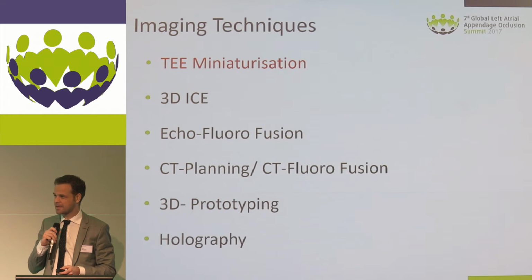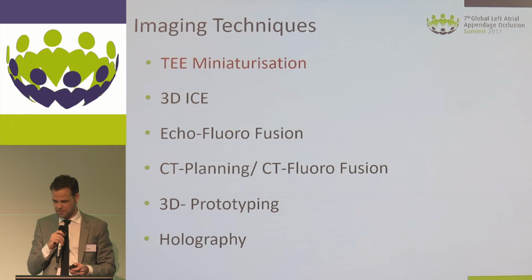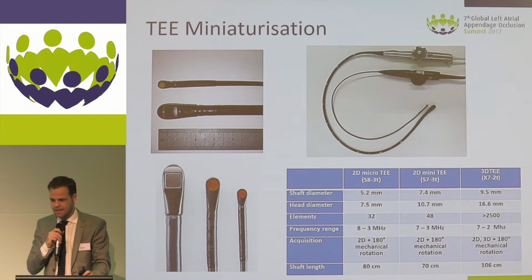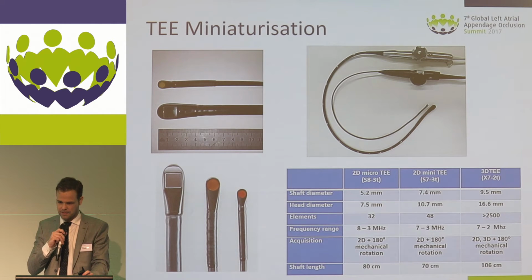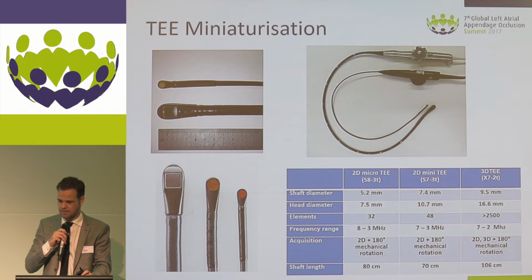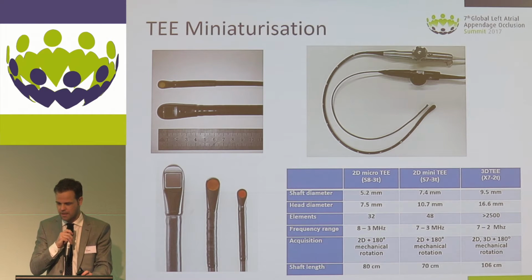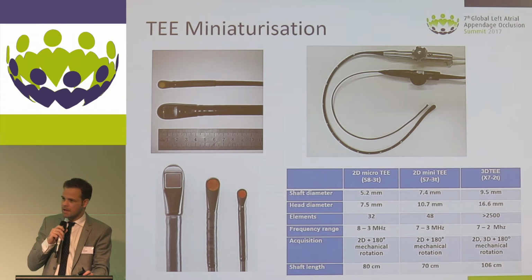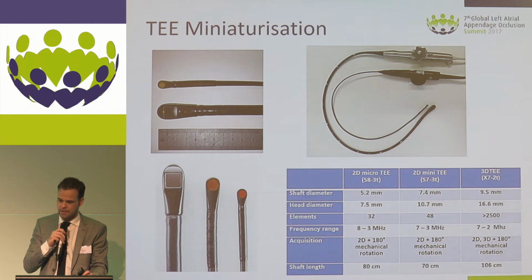So moving on, let's have a look at smaller TEE probes. We have different options nowadays because the biggest burden, and that's why the procedure is frequently done under general anesthesia, is the big TEE probe that has to be in the patient, and that's quite inconvenient for the patient. So getting rid of the TEE probe, going to ICE or something like Sergio Berti does, or maybe we can use smaller probes. I think Nina already showed you the micro TEE, but another option is now the mini TEE. On the downside we can see the specifications of the different probes, so we can see this micro TEE, that's what we most frequently use actually in all our procedures.